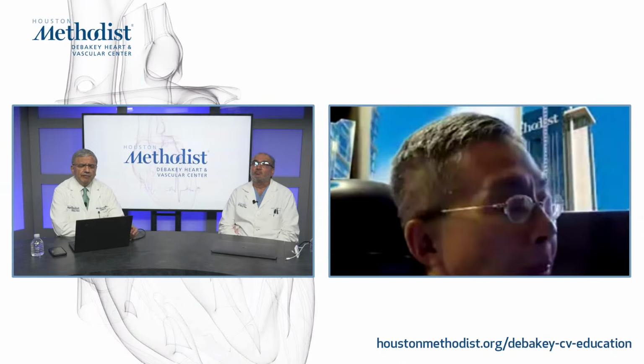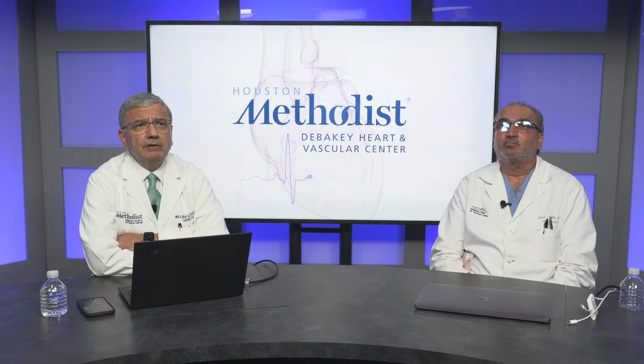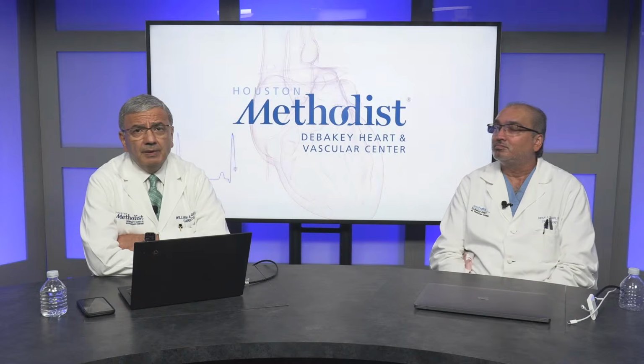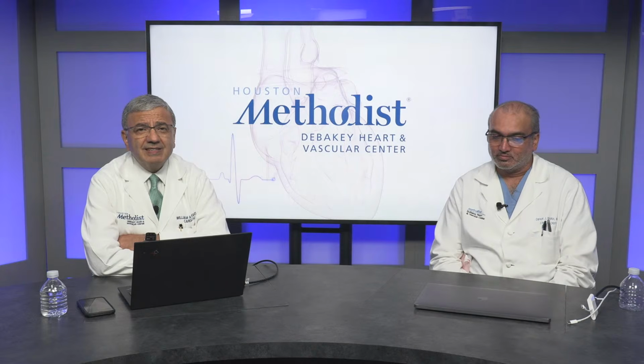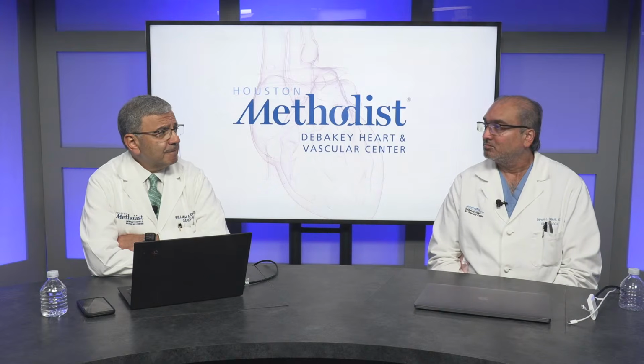I mean, this is very informative because we will see such patients. If you don't have a previous echocardiogram on a patient, there's always a question of prosthesis-patient mismatch, and you want to take a look in a mechanical prosthesis at the size of the valve and its motion. I think it's very good to be able to do that. Yeah.